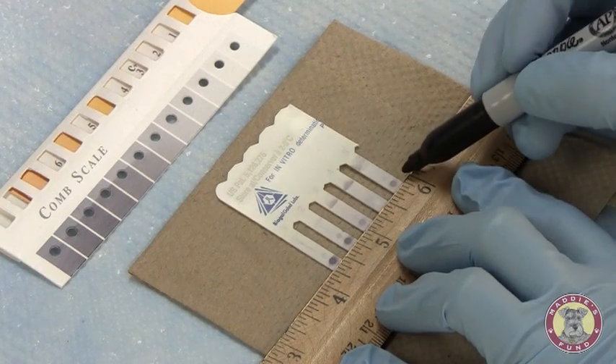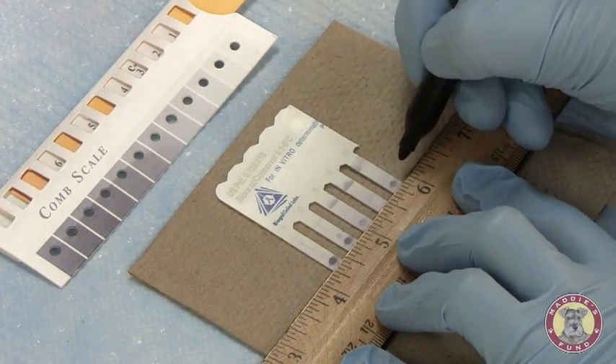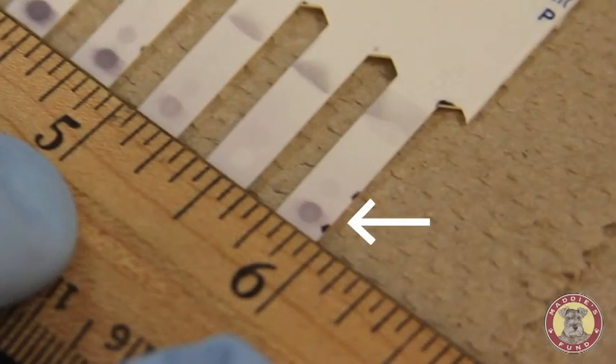Sample 4 I would call a 0 or a negative. Last, for canine adenovirus, sample 5, loaded on the 5th tooth — again there's a high degree of color development, darker than our positive reference. I will call this a 5.